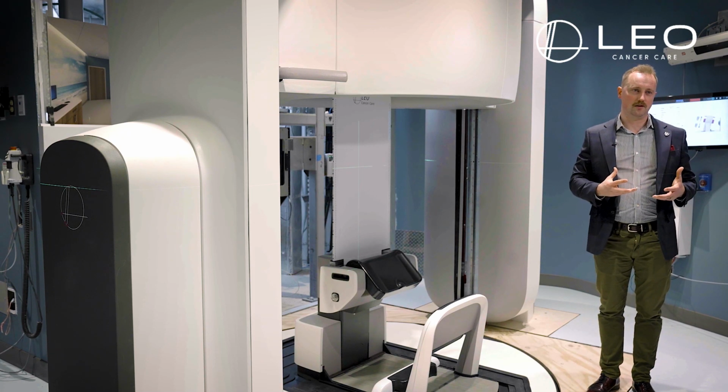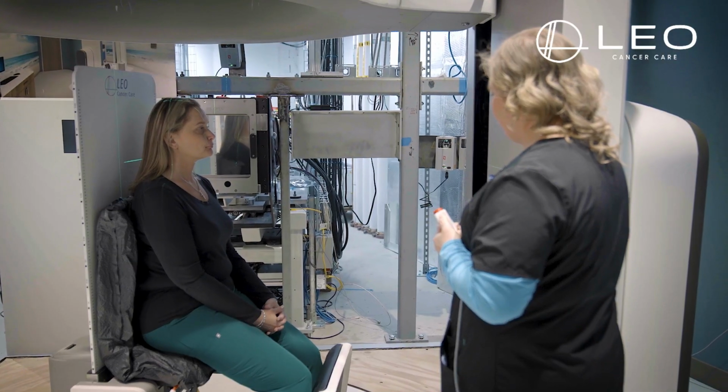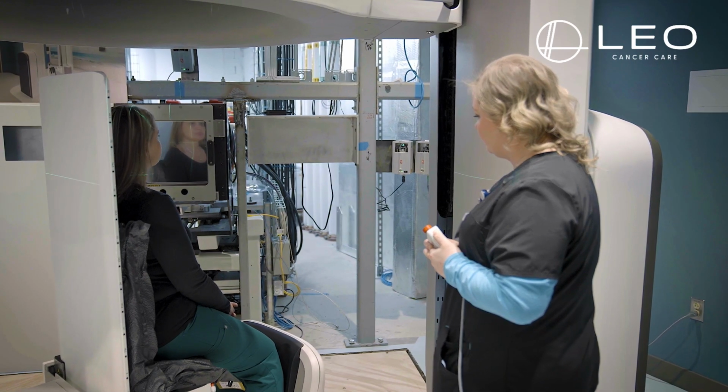And the final step, and really the key to the success with this technology and the key to unlocking global access to proton therapy, is our ability to very, very slowly rotate the patient in their optimum posture in front of the fixed beam. If we think about conventional proton therapy, that used to be done by taking 100 tons of equipment and rotating it with respect to a 100-kilo patient. We flipped radiation therapy on its head, and we keep that 100 tons of equipment fixed, and we very, very slowly rotate the patient instead.